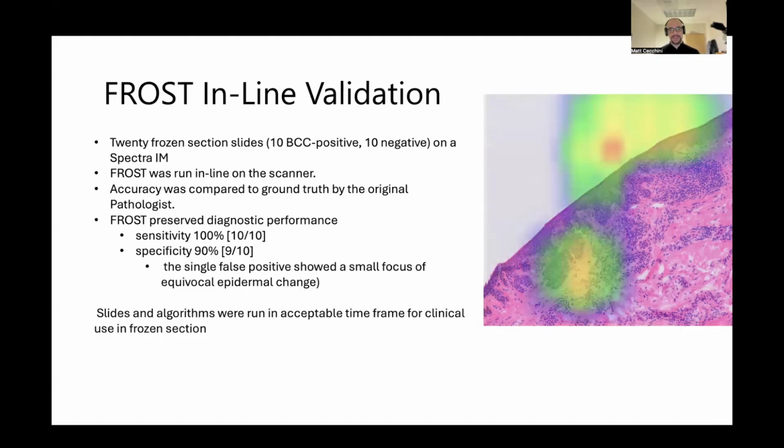And then the other thing is that I didn't do a crazy validation here. I followed the kind of validation that you use for an IHC test, where you don't need a ton of things. So we did a larger study to show this, and then we just did an on-device validation for this. And I think this is a level that is appropriate for use.